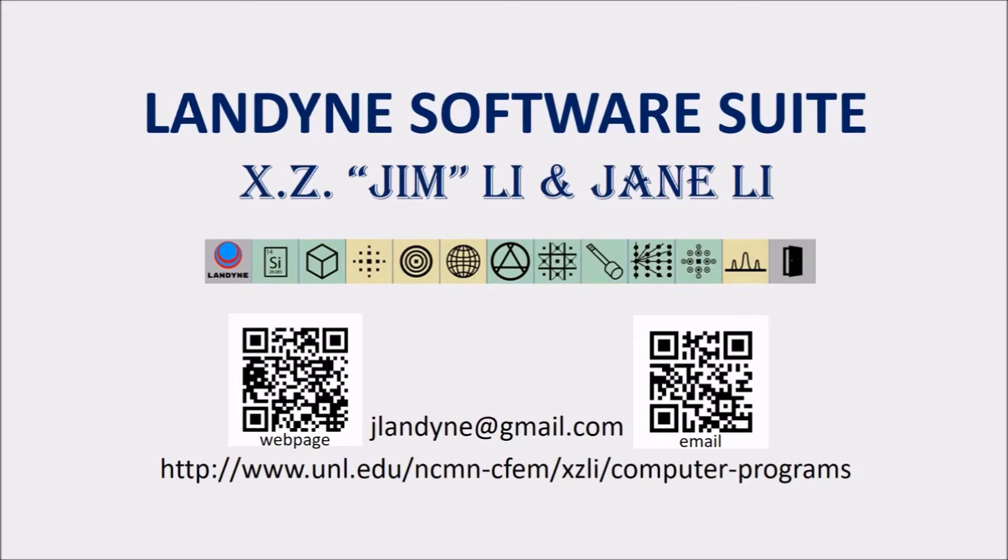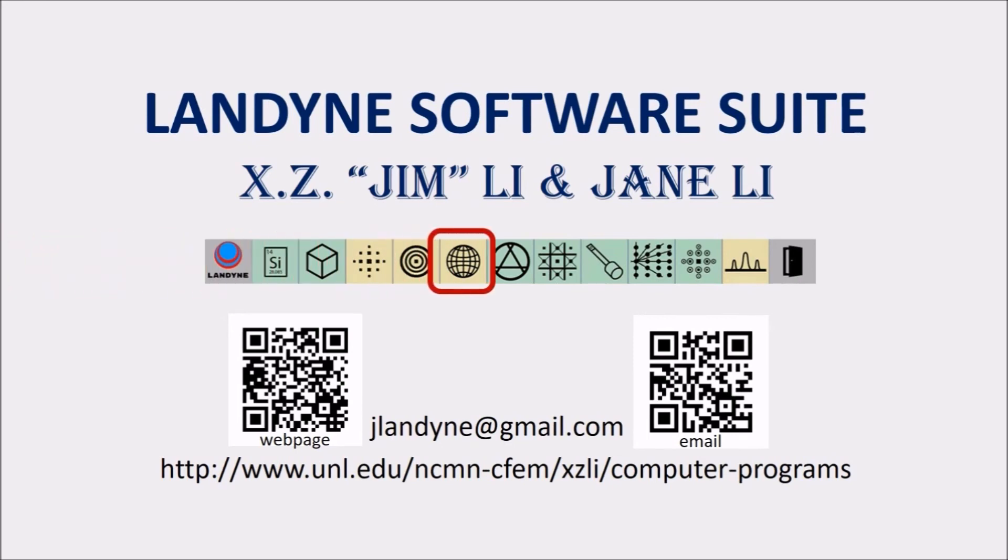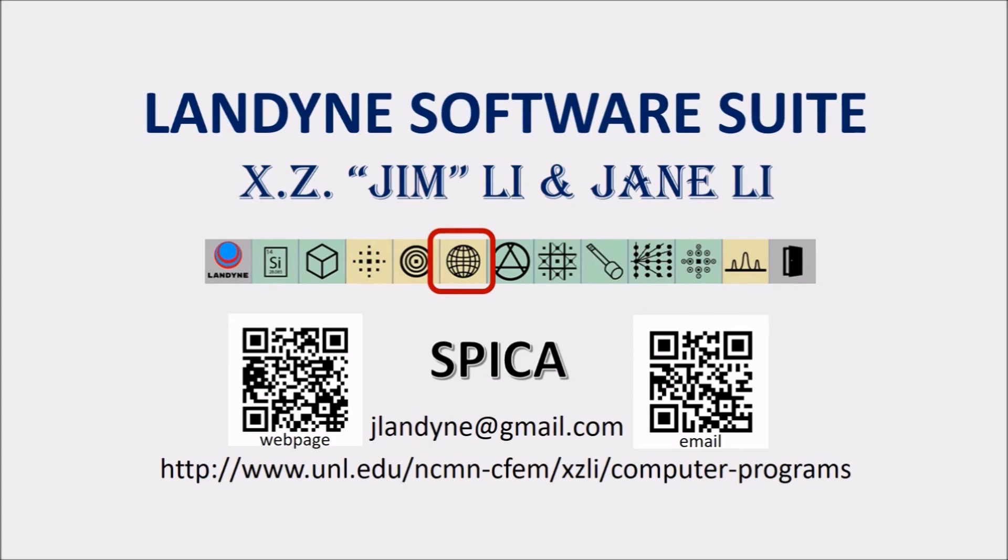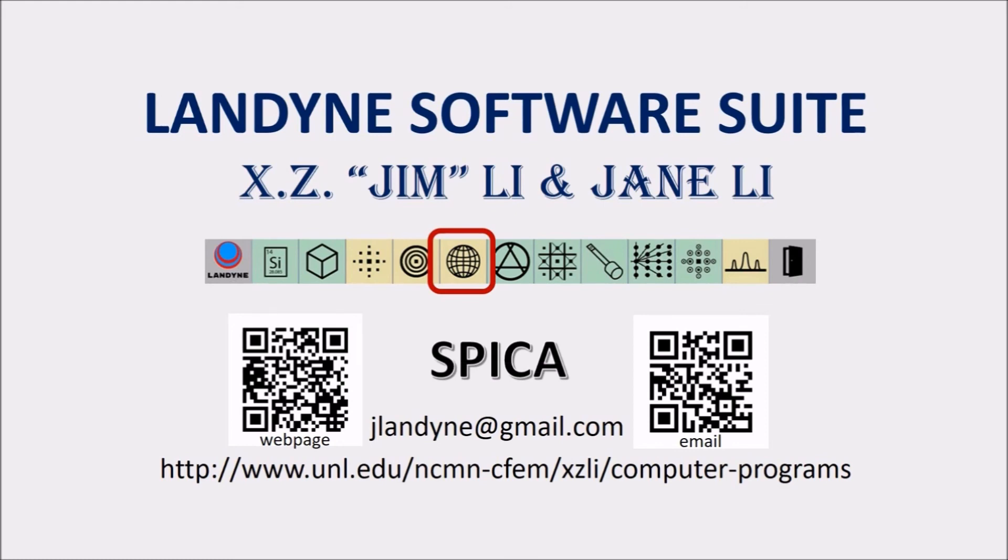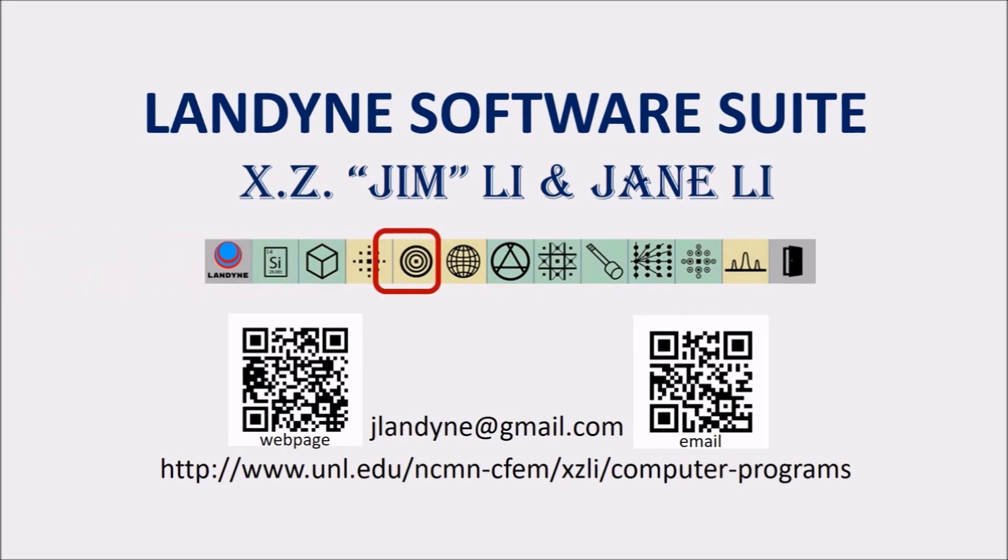In this tutorial video, I will introduce SPICA, a computer software for stereographic projection for interactive crystallographic analysis. The current version is 3B. This is one of the main components in the Landyne software suite.